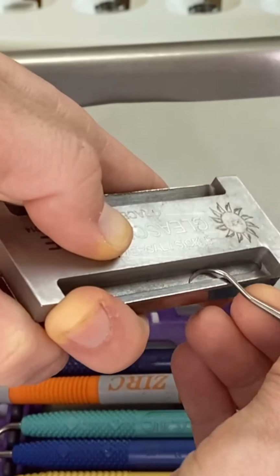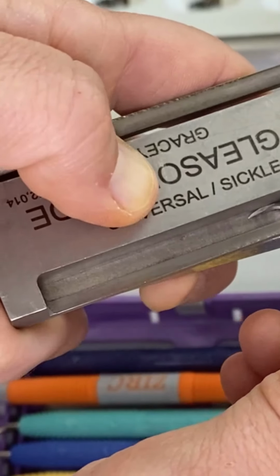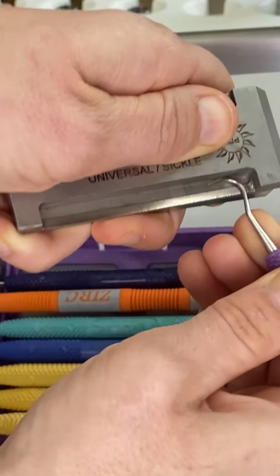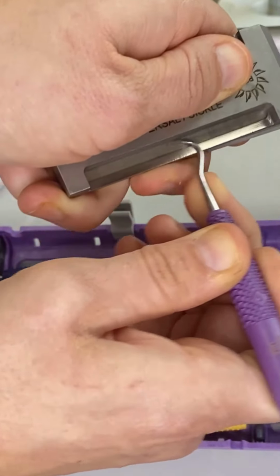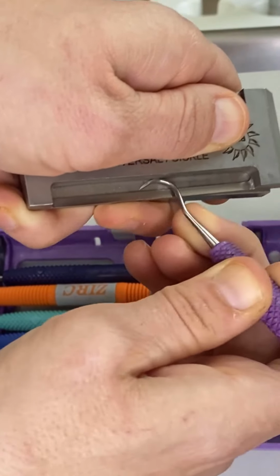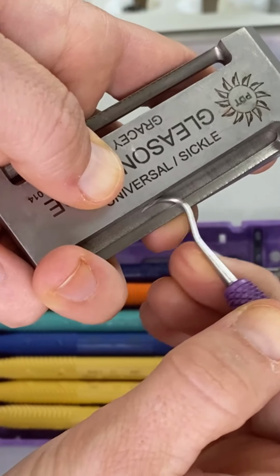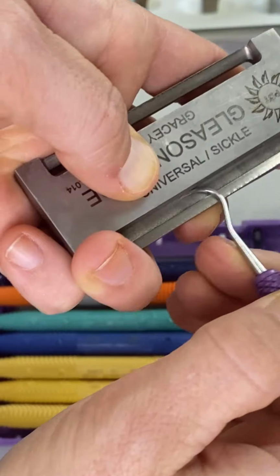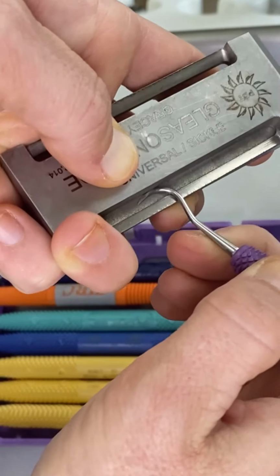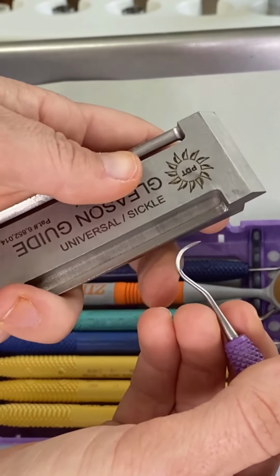If you're doing it like this, if you're too far like this, you're not going to get an even cutting edge, and hopefully you can get up there and see it. So what I do is I have this nice little grip with my thumb, and every few strokes I'm moving it back and forth, and you can actually hear it. Right? I do show people this, and I have them start out slow, really focusing on that first spot, and then they maybe make a little adjustment and do the back end of that cutting edge. But just like you learned with scaling, it's sometimes just a feel.